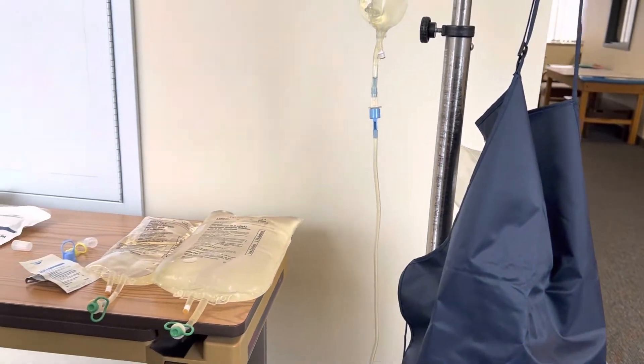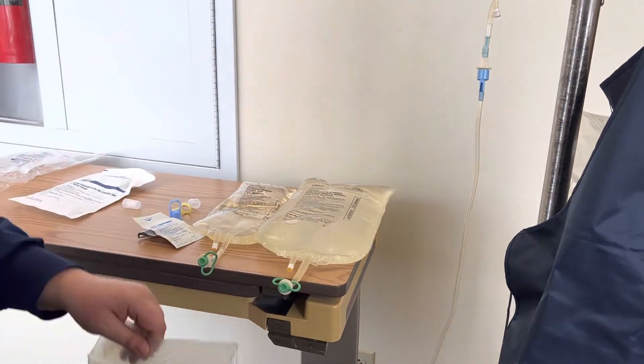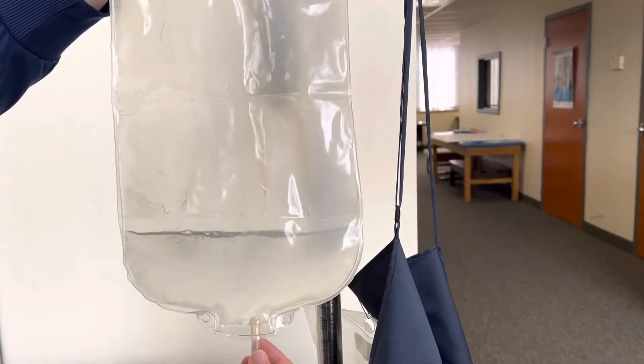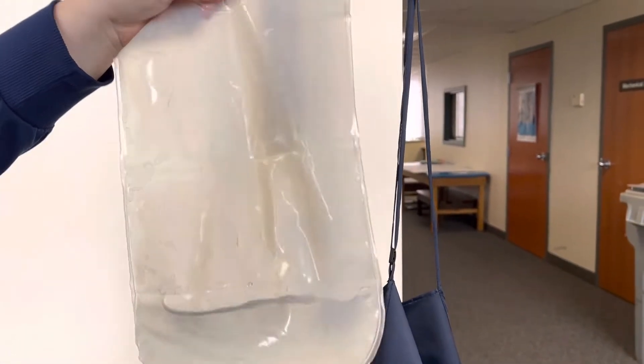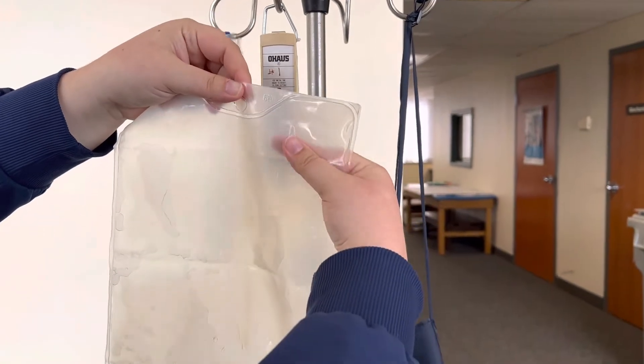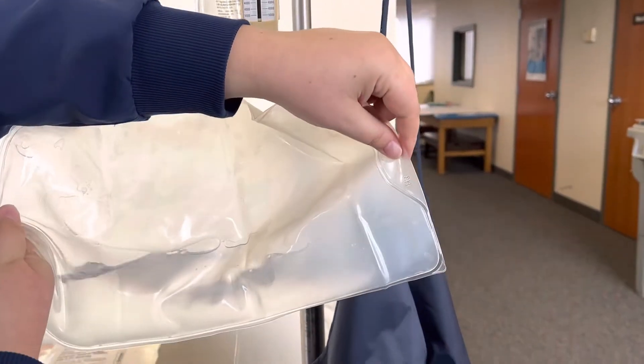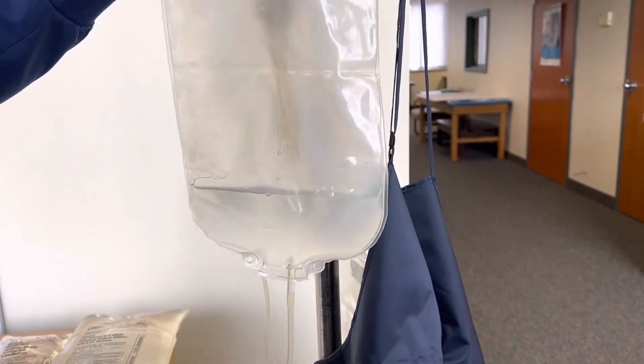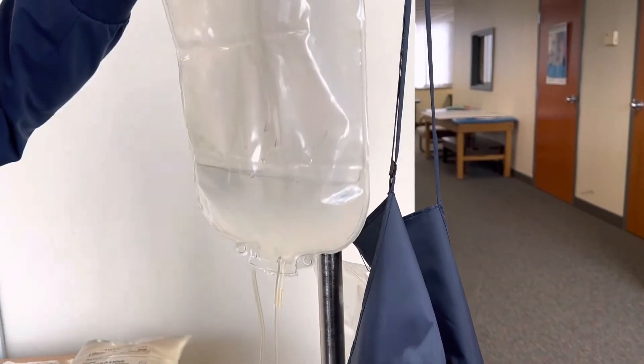One final step — your policy will likely indicate this as well — we do typically measure the amount of fluid in here. You're going to cut this and empty it into a graduate and measure the exact amount so that you can document that. And that's it.